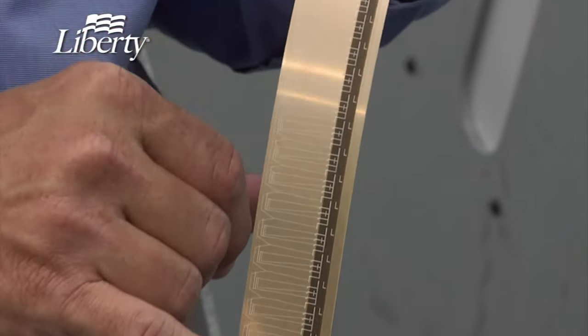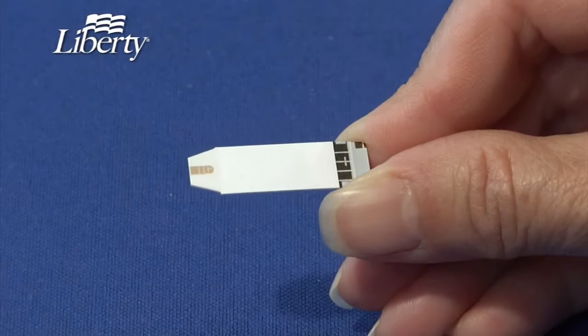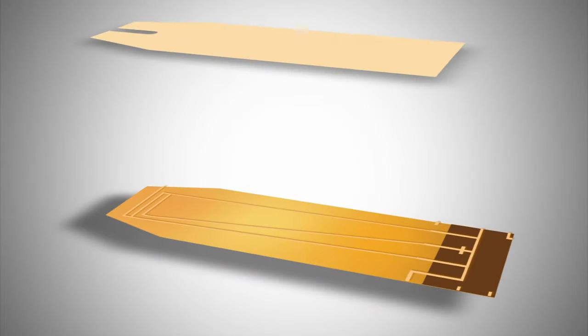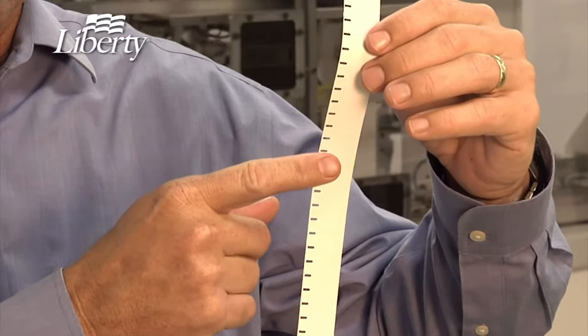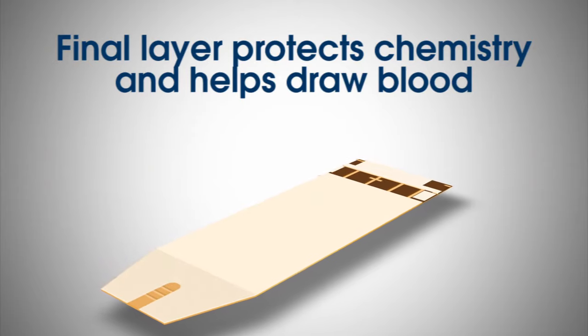We inspect every strip throughout the entire manufacturing process using high-tech cameras. These cameras ensure each strip is manufactured to very precise specifications. Then we add material to protect the electrodes and create a space where the chemistry is applied and the blood is collected. A final layer protects the chemistry and helps draw the blood into the test strip.